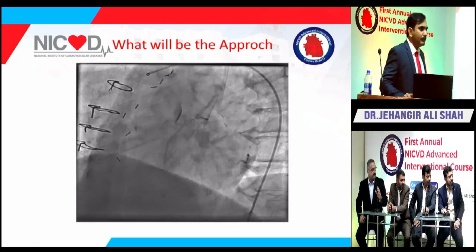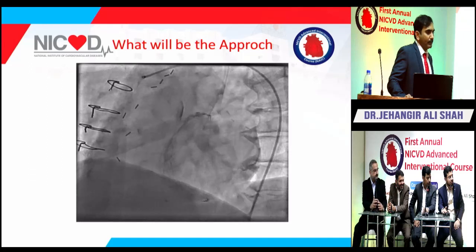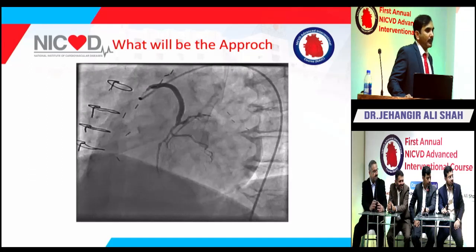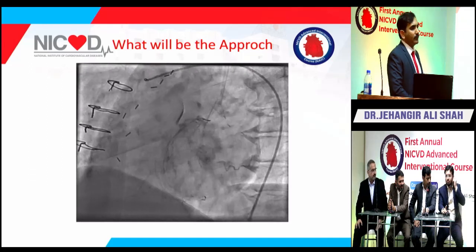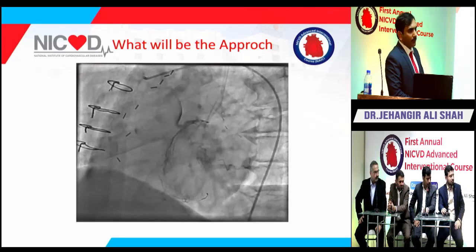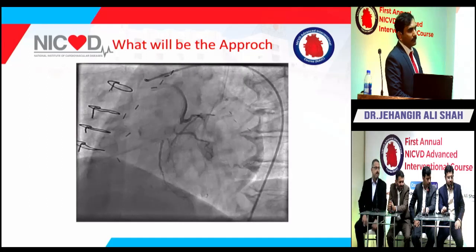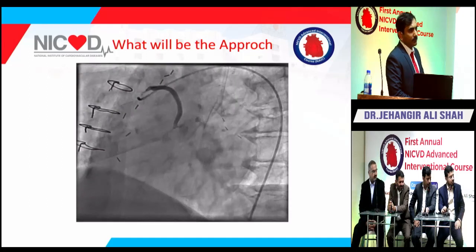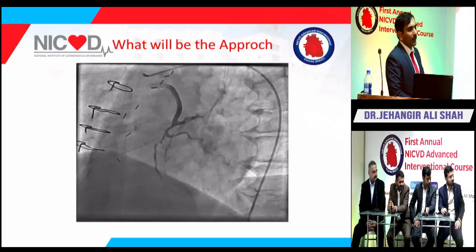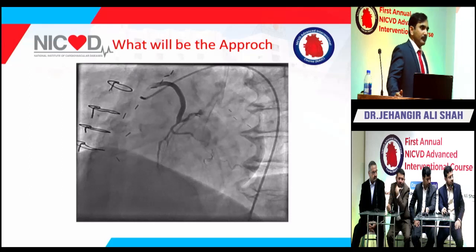Okay, if I may just add, there's a lot of tension on whether embolic protection should be used or not. If you are to classify this lesion, number one, it's an ostial lesion. The most important thing about this lesion is that it is ostial. And ostial lesions, by definition, have aortic tissue, and they almost never have fat in them.